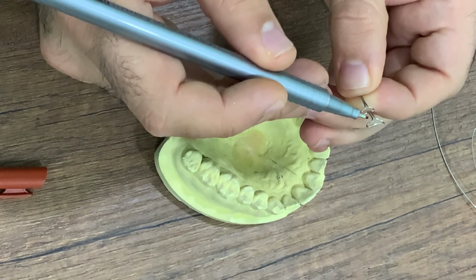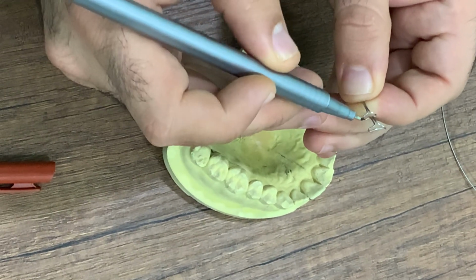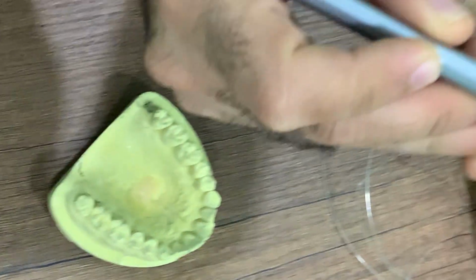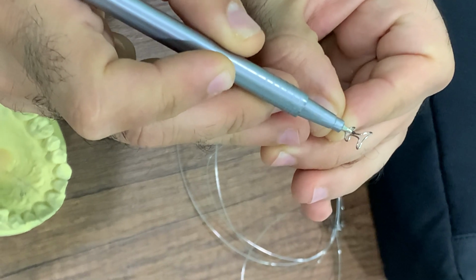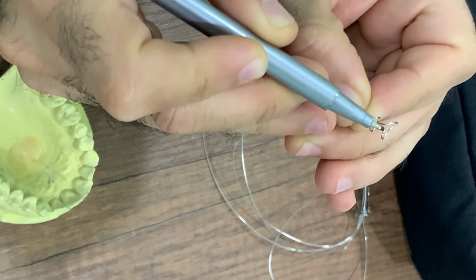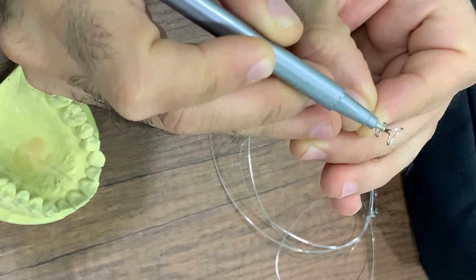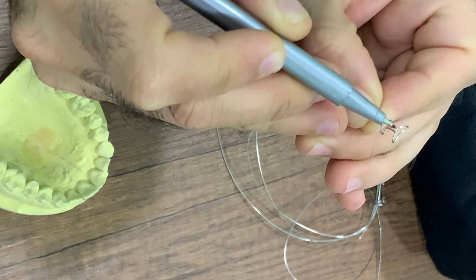Now the second component is the two vertical arms with adjustment loops. Two vertical arms extend vertically about 3 to 4 mm down at right angle to the U loops, separated by about 0.5 to 1 mm from each other.